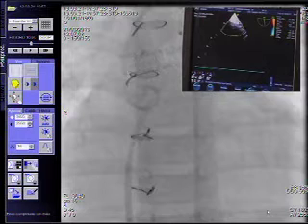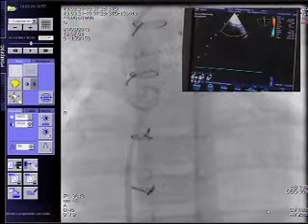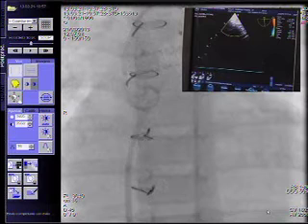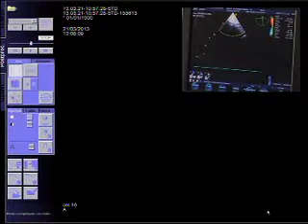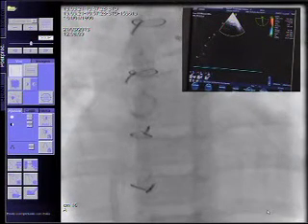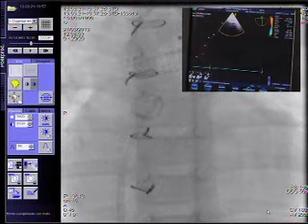So Federico, at the moment there's just the tip of the dilator in the left atrium through the puncture. I think so. The sheath is still well back in the right atrium. Pero no lo coge. I'm not sure whether it is in the left or the right atrium. What do you think? It was hard to see. To me it looks as if you just have the dilator across, but maybe that's enough to curl a wire in the atrium and then proceed from there. So, mete otra vez la sonda, por favor. We'll see on echo.